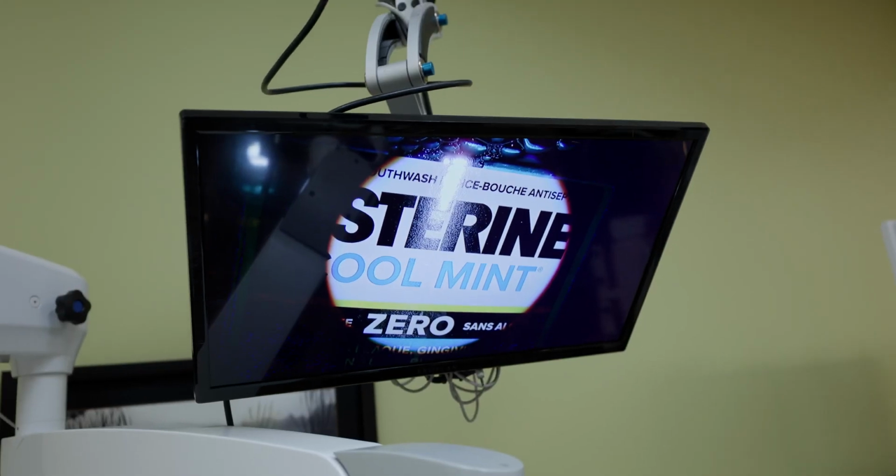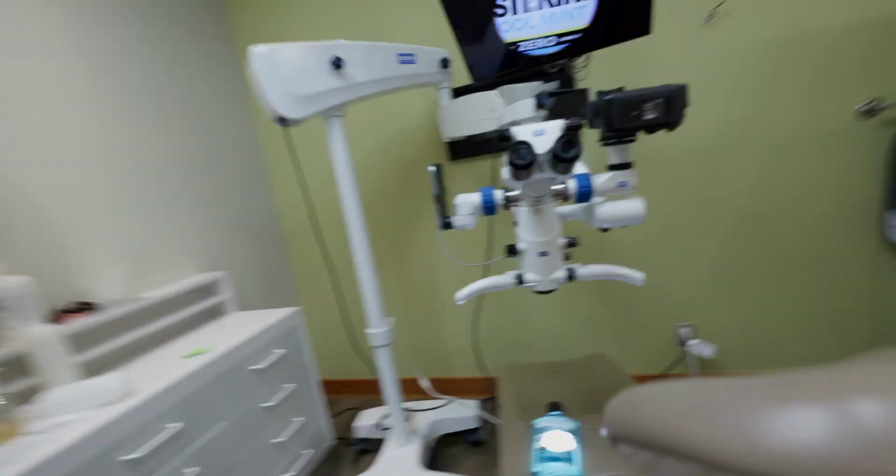But if you're working in the upper anteriors, it is so annoying when you can't dim that light down and then the light is just everywhere in the patient's eyes. So really, really nice when you can narrow it down so that you can only have light where you're working and not in the patient's eyes. So that's a really, really nice feature.